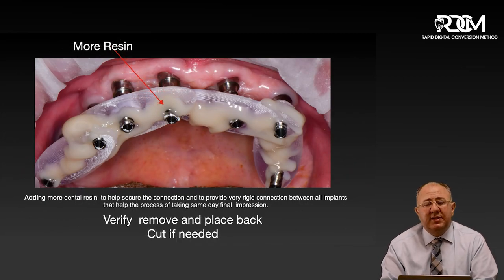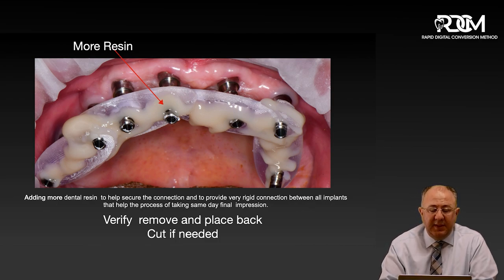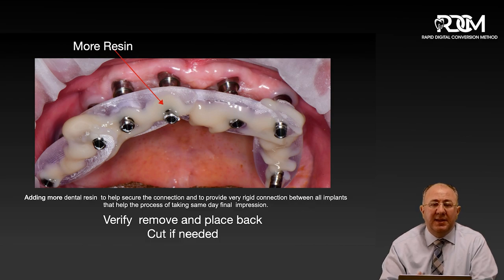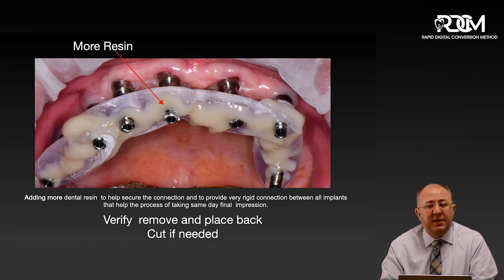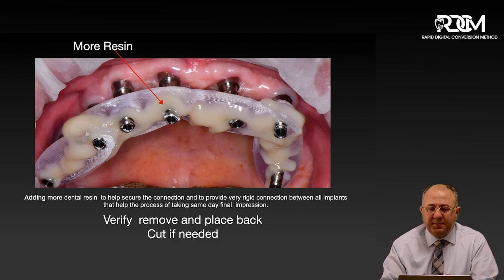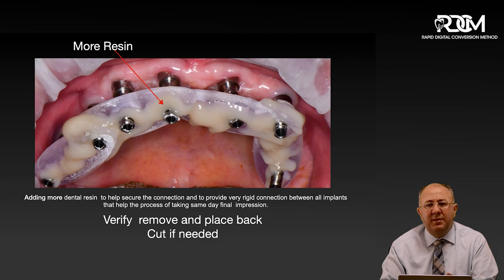The next step is to add more resin to the connection to confirm it is really stable. Then I take the device out, unscrew it, look from inside, and add more resin on the inside to eliminate any voids and prevent any movement. Then I put this instant verification jig back in place. You can tell it is passive when seated — you can feel it with an explorer and have access to all the connections. If the verification jig is rocking or not stable, you can cut the resin and add resin back to it, the same way you would with a standard verification jig.